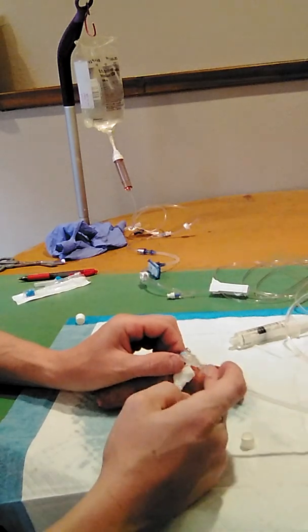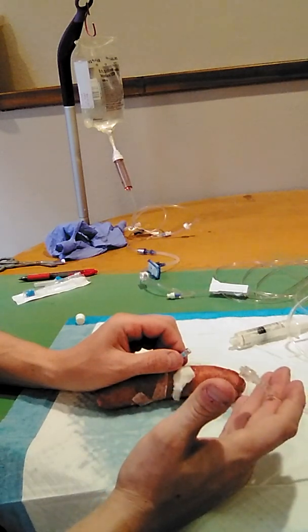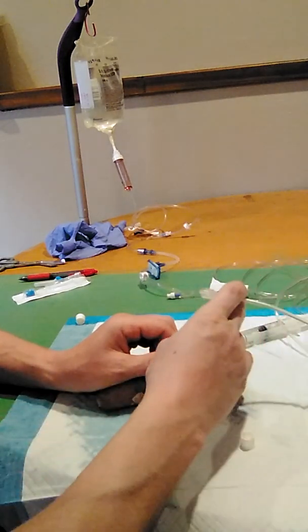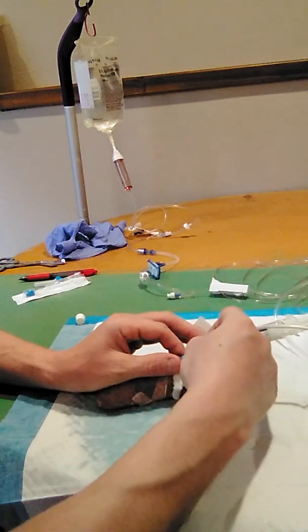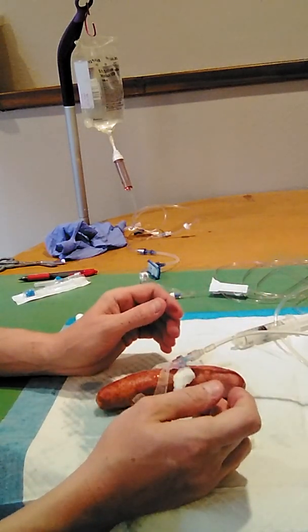And I'm going to observe the IV access site. So I'm inspecting for any redness, swelling, pain, tenderness, any infiltration. And so I've removed that flush. I'm cleaning these ports and hubs with alcohol. Okay, now that's connected again.